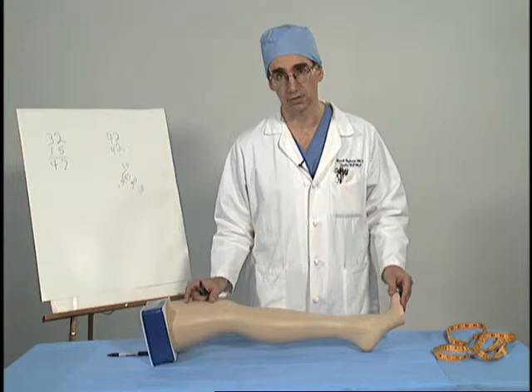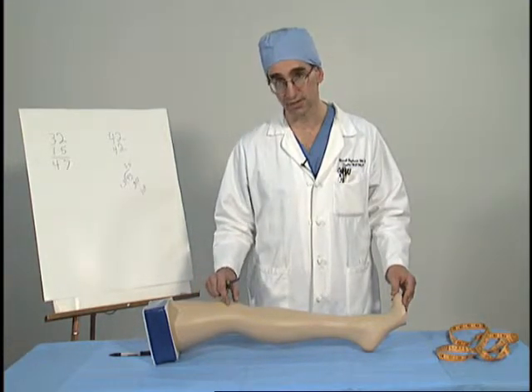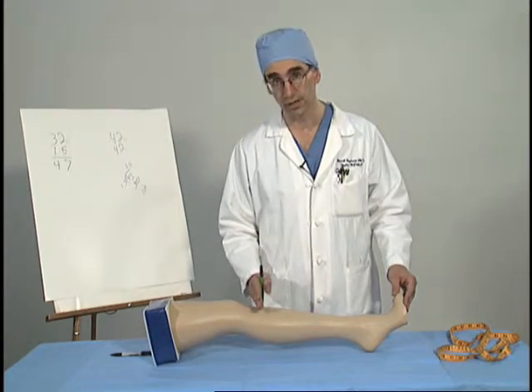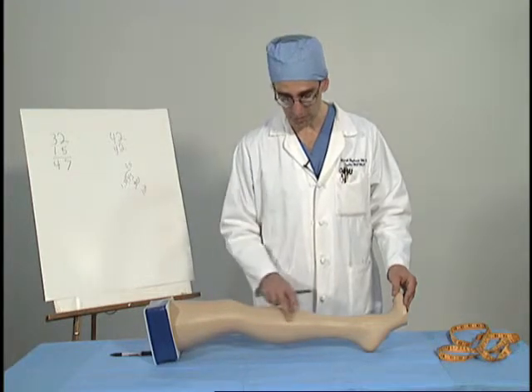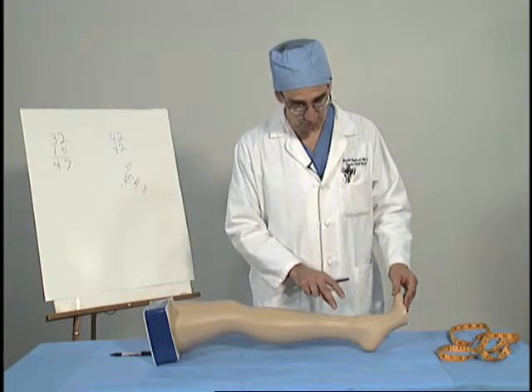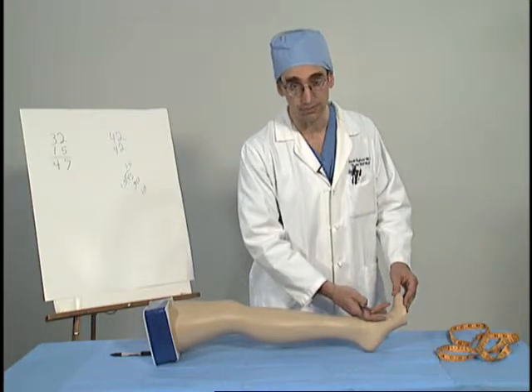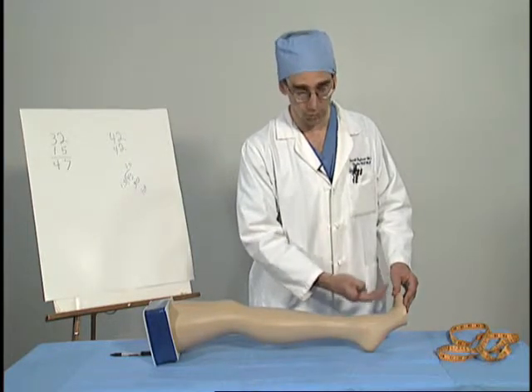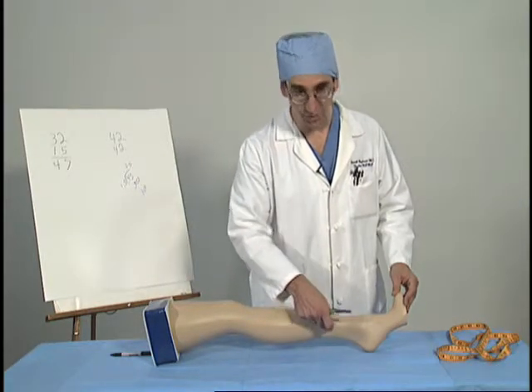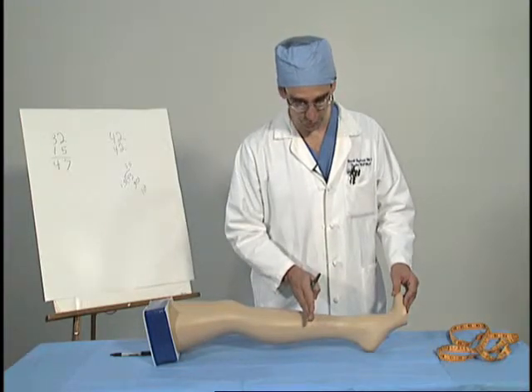So in this case, we have adequate inflow to the knee and below, despite the fact that the superficial femoral artery occludes. We see robust collateral flow into the geniculates, reconstituting the popliteal artery. That then follows below knee and reconstitutes our tibial vessels across the calf. In this scenario, what we primarily need to treat is the foot, and then when we have moved past that, we've decided that we'll treat back along the posterior tibial artery in order to create an improved gradient into the foot.